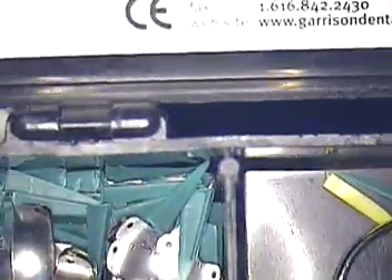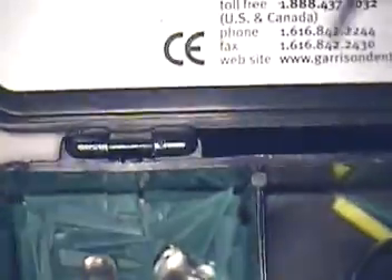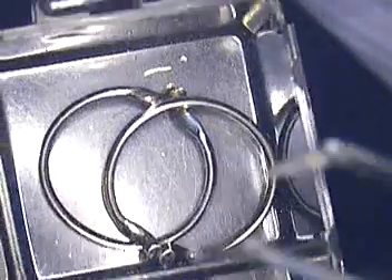Let me have a pickups and we'll go ahead and get that out — that's the one we're going to use. There's one on the tray. We need a clamp, so we're looking for the clamp we want to use. Looks like somebody took all my small clamps — she's already telling me what to do versus me telling her what to do.